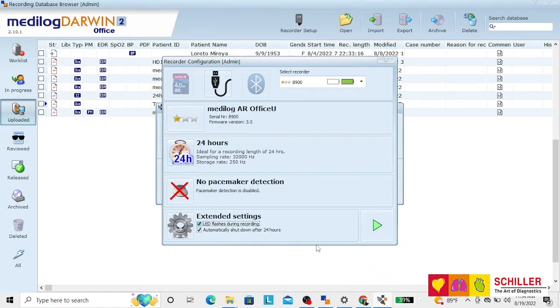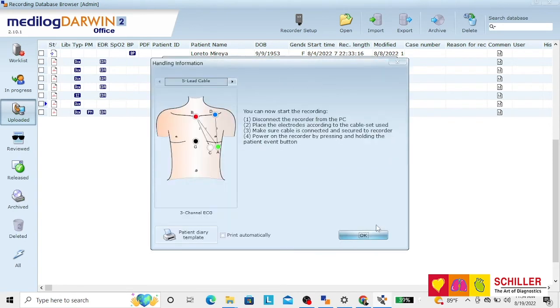At that moment you just click on the configuration. Now the configuration has been installed to the recorder.